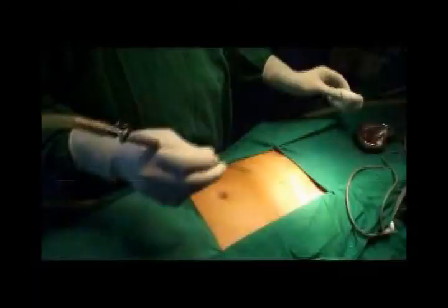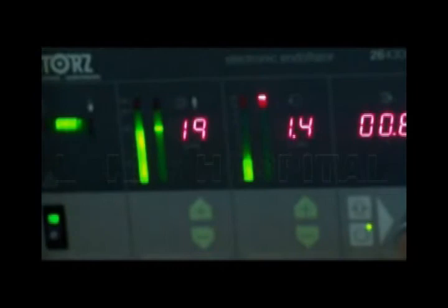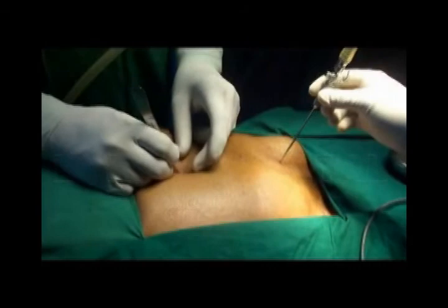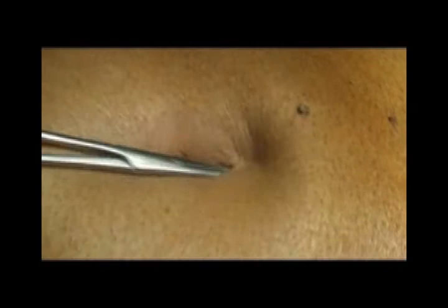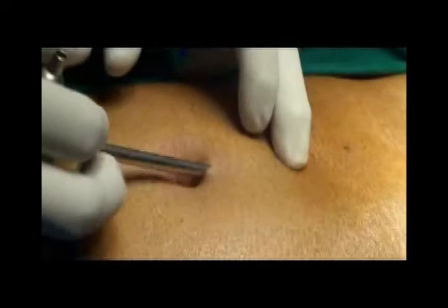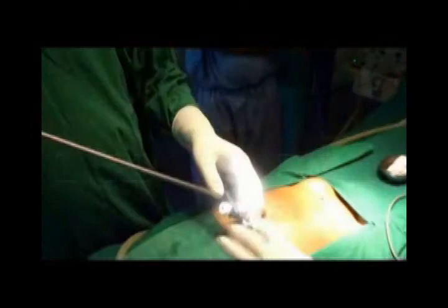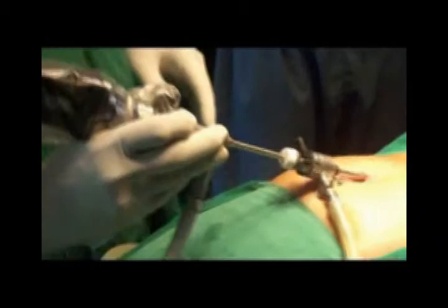You are going to see the video clip which demonstrates what I have already described. The pressure is set at 20 mmHg, and that's a subcutaneous tunnel being made using a straight artery forceps. That's a 5 mm metal port, punctured at 4 cm from the umbilicus, going straight down to the space of Retzius — you can see what is happening. It's already there; that seems to be a direct hernia.